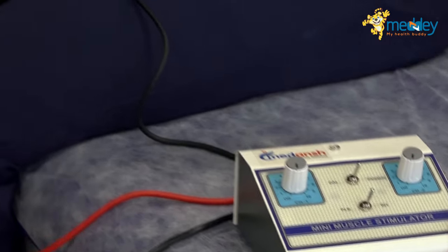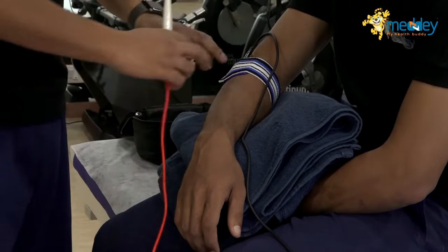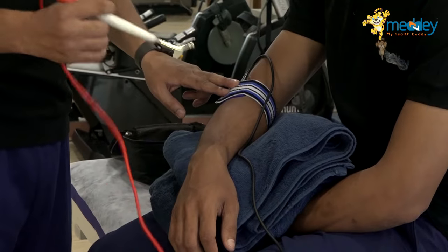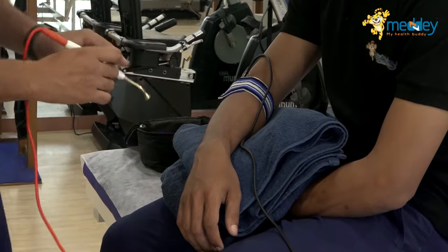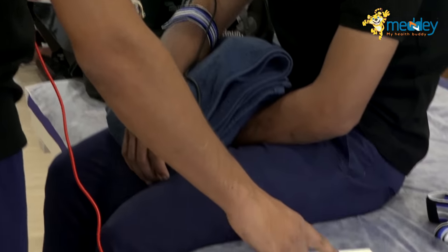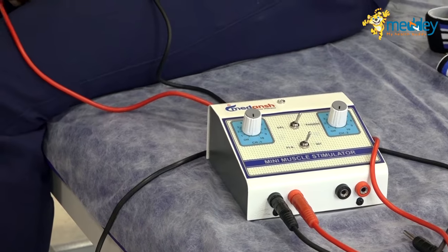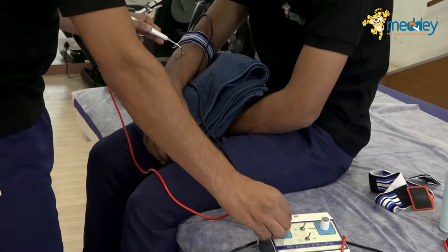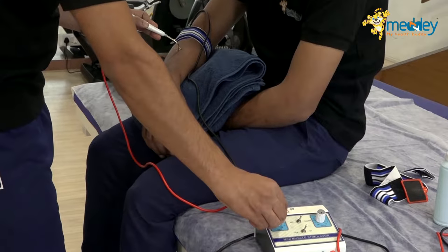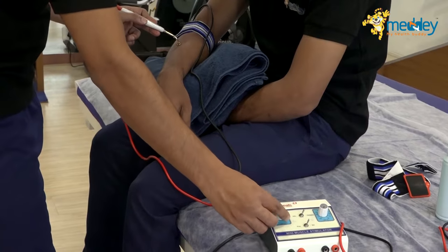I'm stimulating the extensor muscles here. I have one electrode on the common extensor origin, and the other is a pen electrode for muscle-wise stimulation. I'm using a faradaic current with the active electrode — the pen electrode — and adjusting the current to get the desired amount of motor contraction.